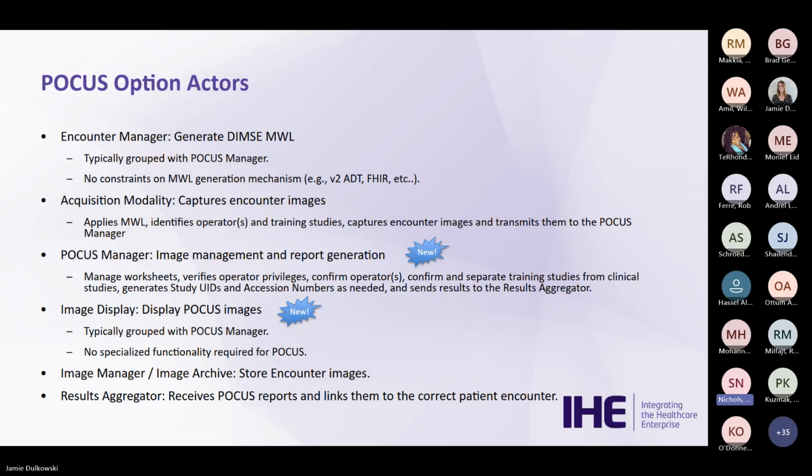As Rob mentioned, this is all focused around the fact that in point-of-care ultrasound, the healthcare delivery organizations are responsible for their own privileging for POCUS operators. Unlike radiology workflows, where all of that is governed by the state or other jurisdictions, there's a pretty heavy burden on facilities that implement their own POCUS programs. Next slide.